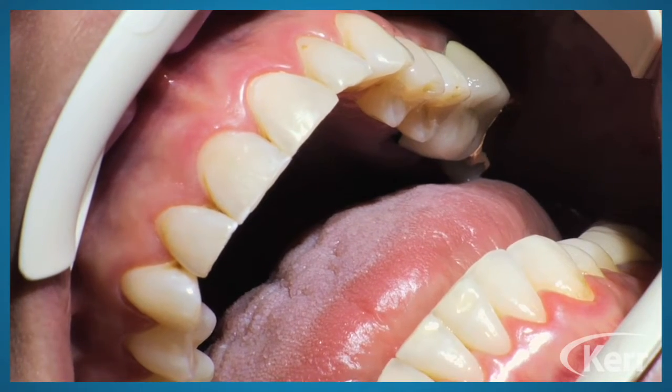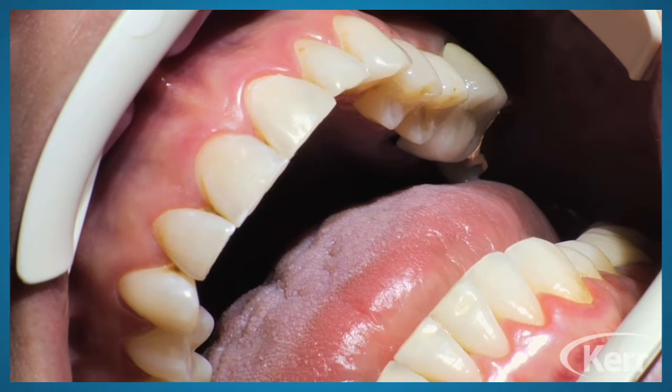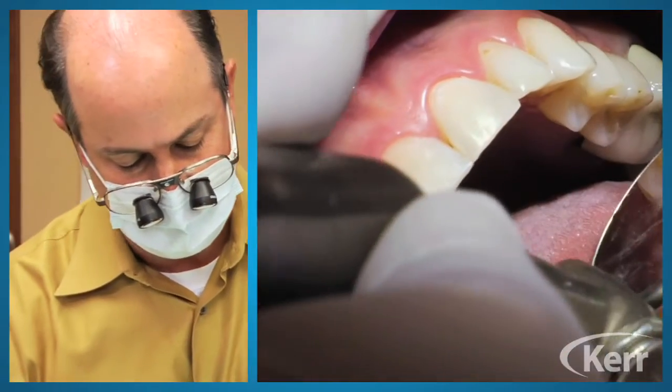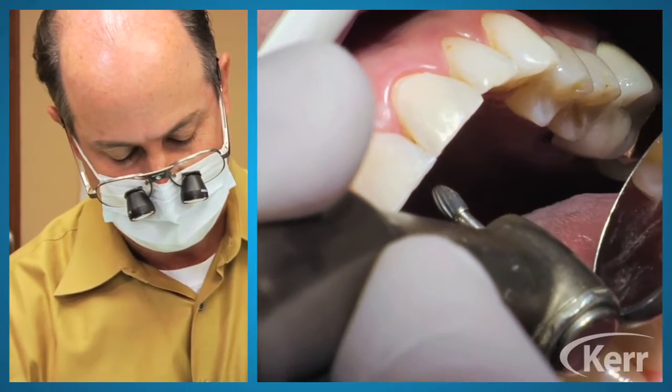And many times I'll work on the lingual first, and you'll see I don't have a lot of extra flash, but we just want to get everything nice and smooth and comfortable for the patient so their tongue doesn't catch anything and they'll be able to floss nicely on this restoration. I think you can tell already that it's a pretty seamless restoration there.